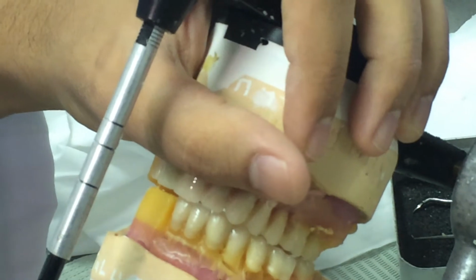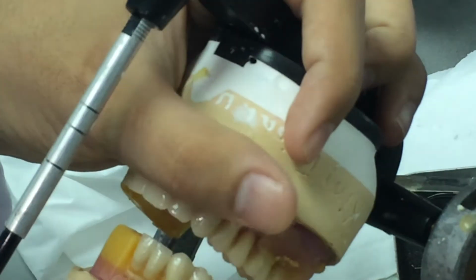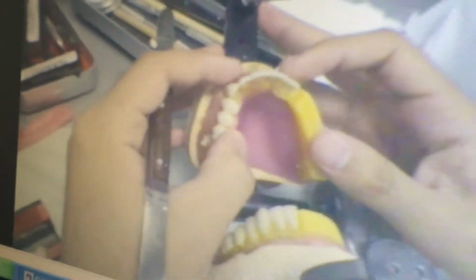Good. Here I have to compare the two sides. Two centrals are on the same level and I have to see it from here too. From this side. Okay?